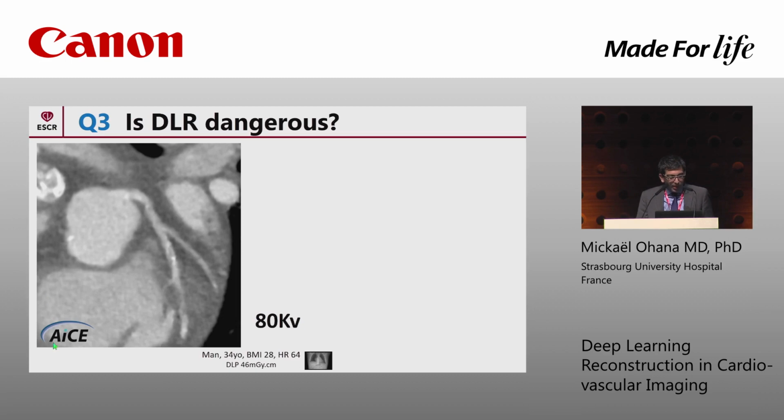This is what we obtained with ACE, and you see in the mid-LAD, it looks like there are some hyperdense lesions here and maybe a hypodense lesion here. Not sure. This is surprising. And when we saw that, we saw also here some hyperdense lesion, maybe here, maybe here, maybe here as well. Not sure what it is.